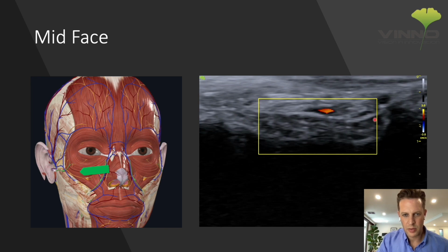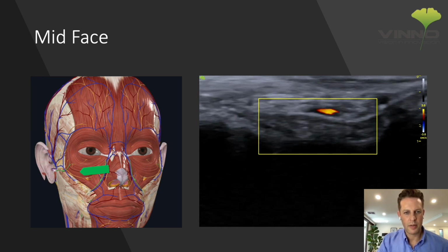We can actually see some of the muscles here. So this is the LLSAN muscle, the superficial part of that and the deep part of that as well. And our LAO and LLS muscles should be around this area here, and this is going to be our superficial medial cheek fat in this compartment here. So let's just play this video and we'll have a bit of a look at this in live imaging.